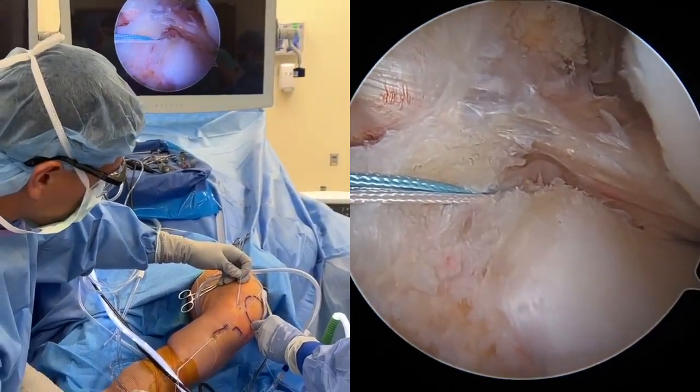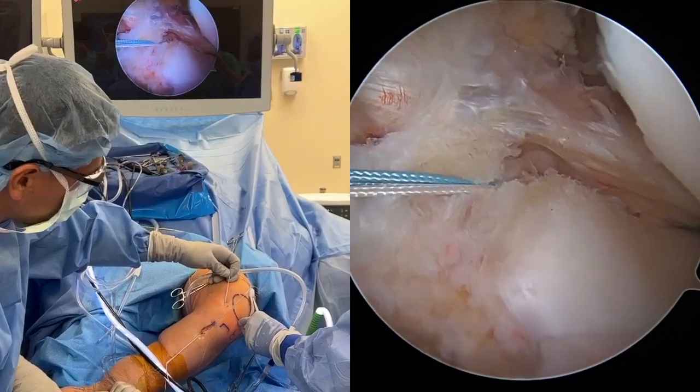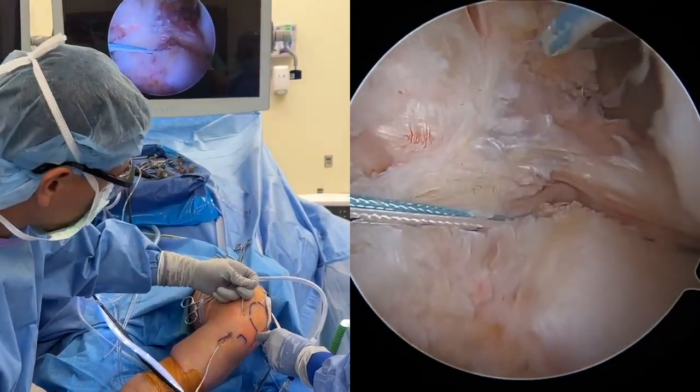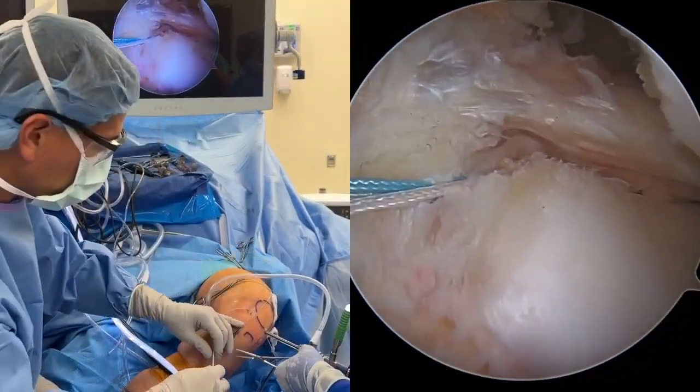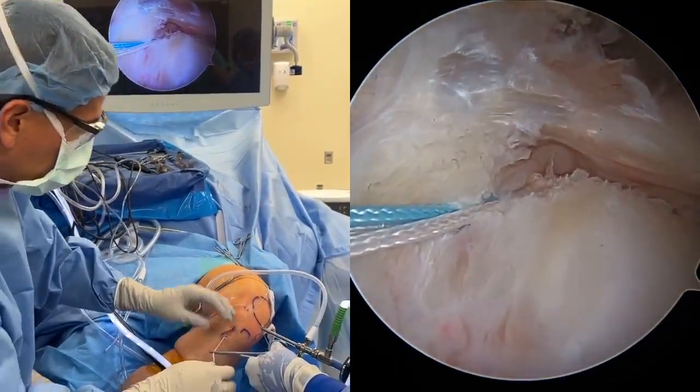The anchor is set by pulling on the tensioning suture loop. After ensuring the anchor is seated, a safety hemostat is used to secure the main anchor sheath at the anterior tibia.